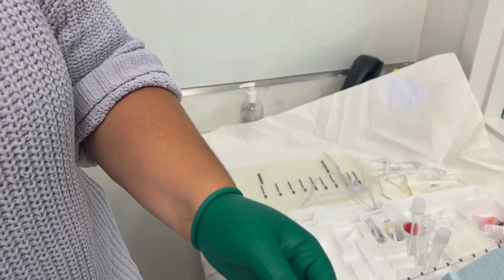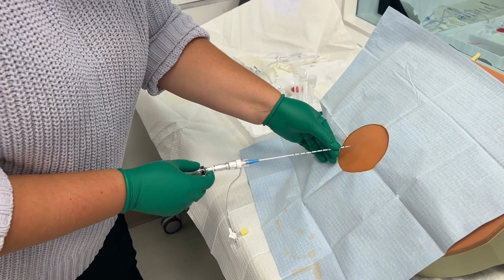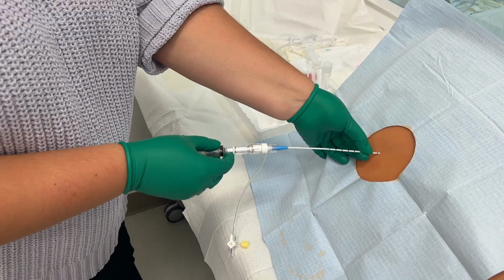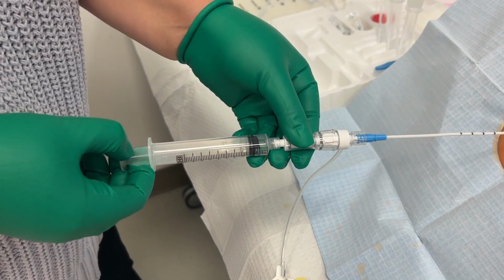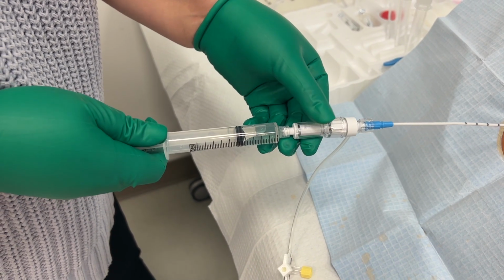Using a pistol grip, you can bring the safety centesis needle to the area where you've made the nick with the scalpel and slowly and gently insert the catheter until you feel a loss of resistance. Then you can withdraw the syringe to obtain your ascitic fluid.